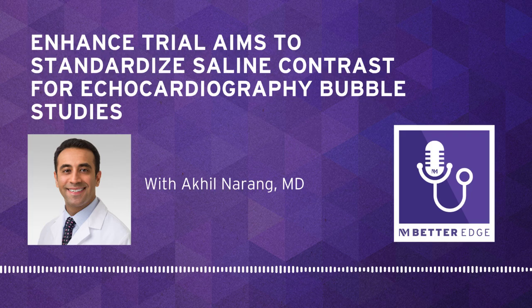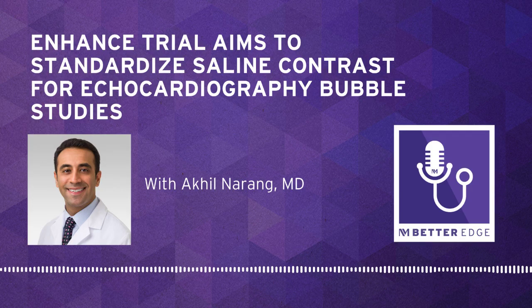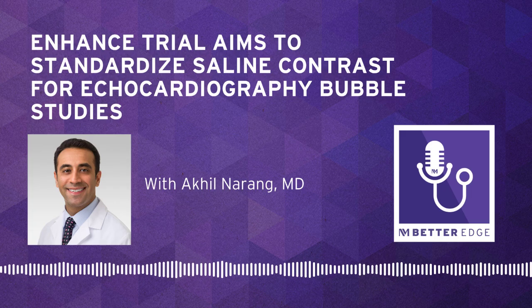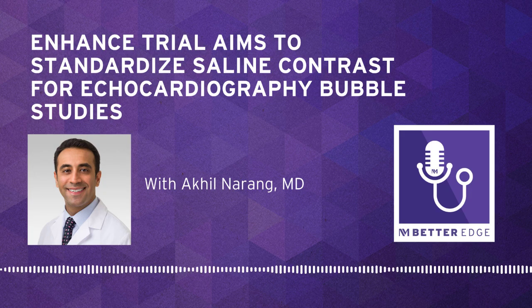As I mentioned, there's polysorbate 80, which is basically a non-ionic surfactant that's commonly used in pharmaceutical preparations. That's part of the tool that we're using for the agitated saline study. It's a larger group of polysorbates, which are well characterized and have a common structure similar to other things that are already used medically. And so the safety profile has been very safe at this point in time. The US FDA has really high thresholds after which polysorbate becomes potentially unsafe, and so the agent is well under those maximum daily exposure thresholds.